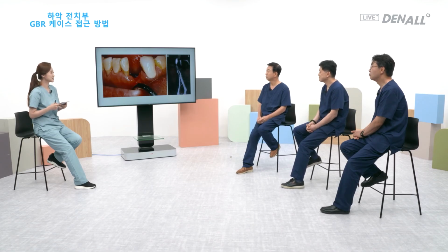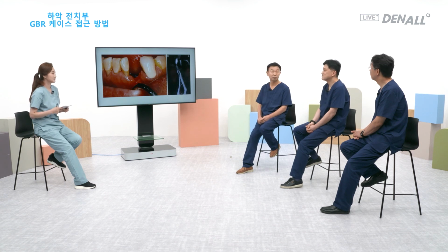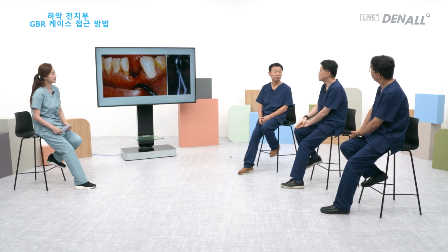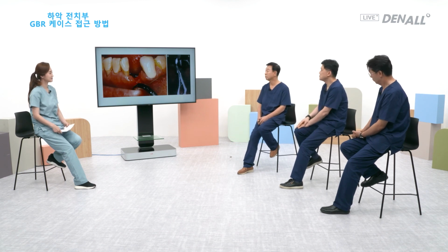Dr. Jeong talked about MS implants. Dr. Sun, do you have anything to add? I prefer to use two-piece implants. I also use MS implants. To be honest, if you just concentrate on that case, my first recommendation is a bridge.